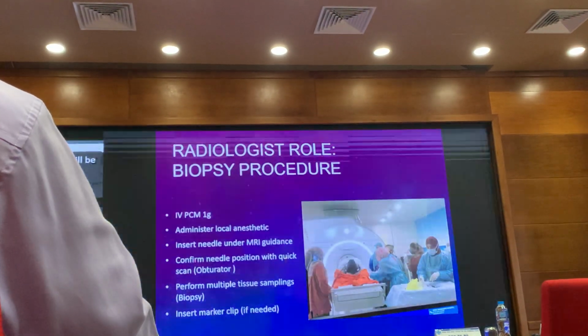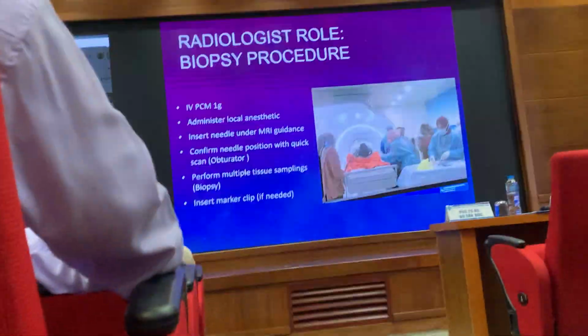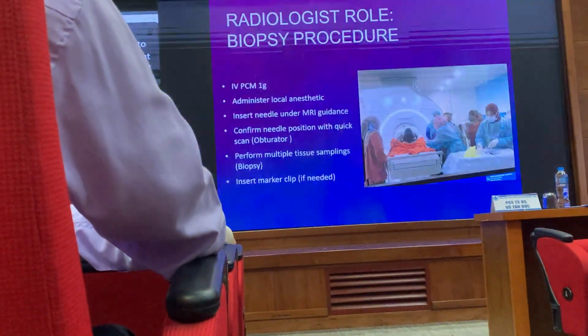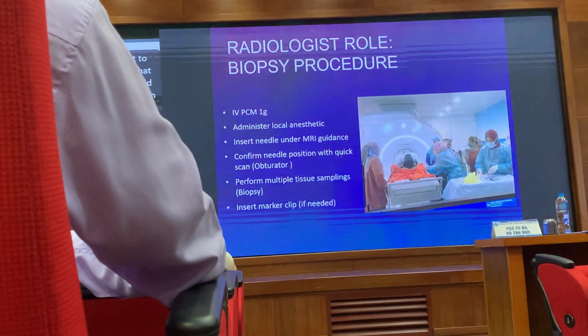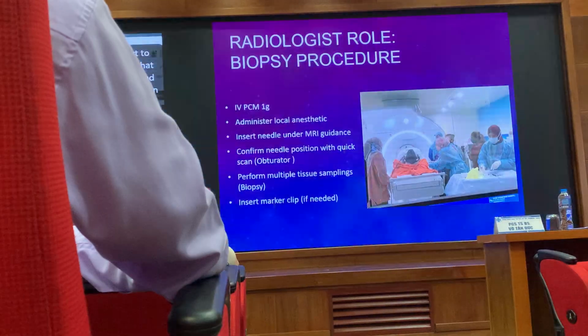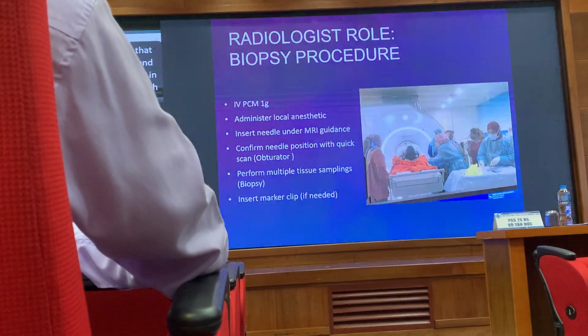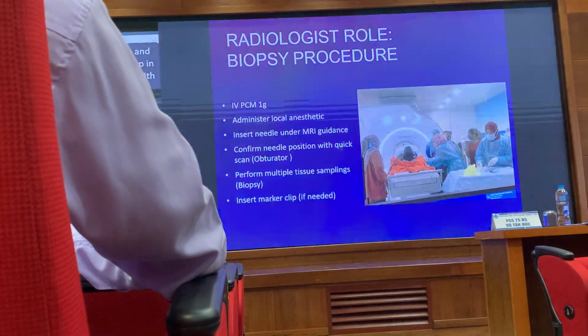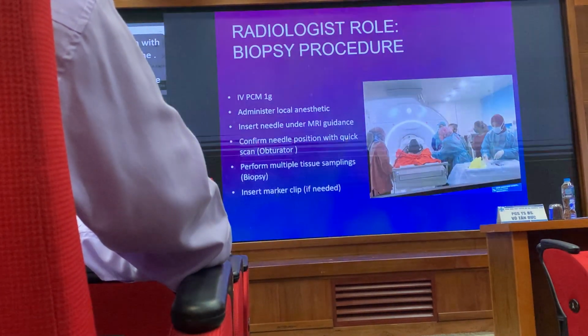So after that, the radiologist gets the exact location and the depth is 2 cm. Then we will set in using the needle to poke in with 2 cm. And before we get the biopsy cell, we will put in the obturator first to make sure that's the position, the exact location of the lesion before we do the biopsy.